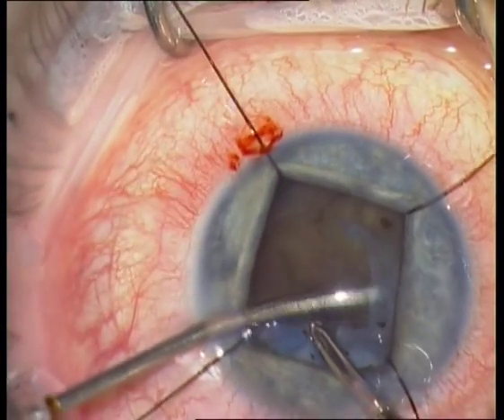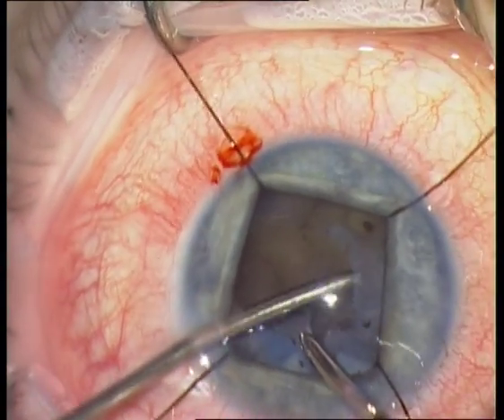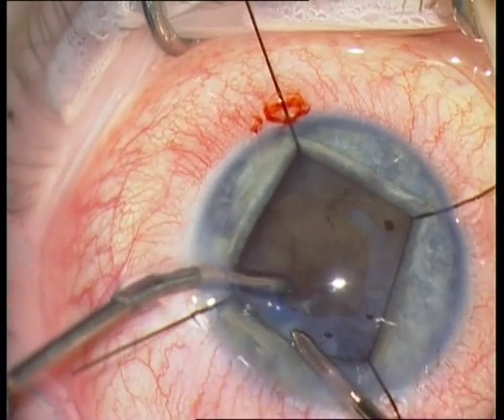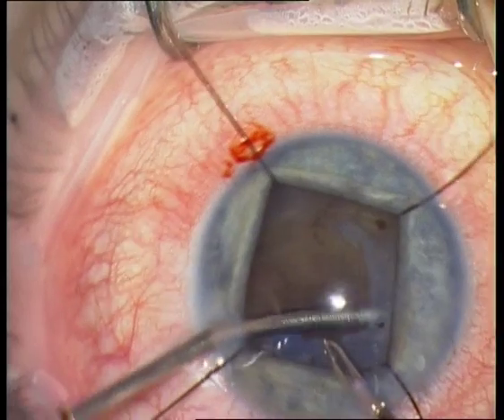You can see now that there is no red reflex in the eye and the vision behind the lens capsule is very poor. The simple reason is a total retinal detachment. But this is another story.